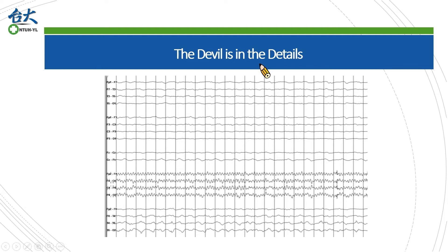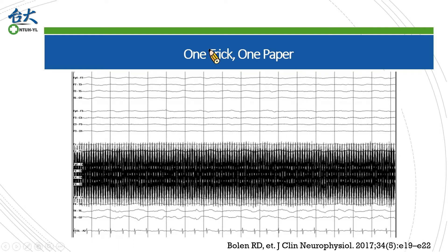We can identify them as artifacts because of their regularity and poor field. This is also a trick — by adjusting the paper speed and the high frequency filter. If we restore the settings, we can see the culprit: they are 60Hz artifacts from the environment. The most important lesson is, if you have novelty and courage, you can have a publication in a great journal.